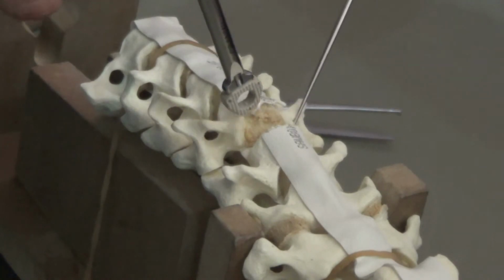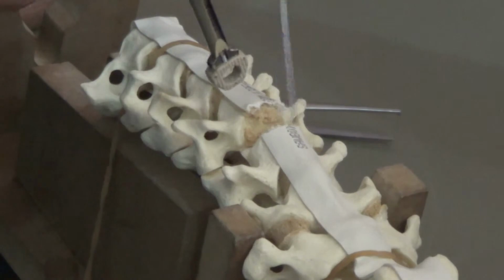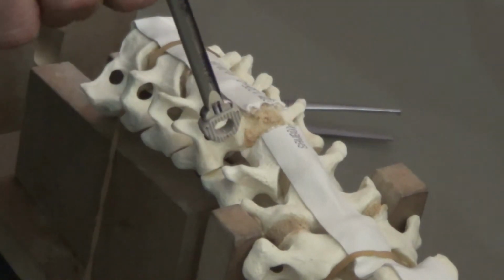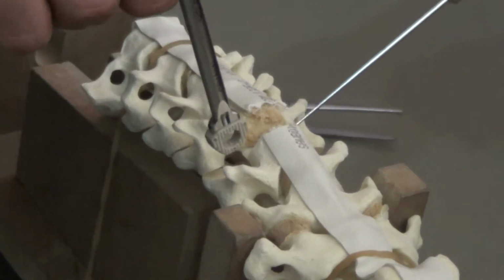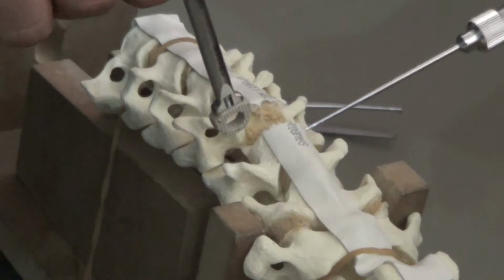Laterally, you will go that path. Sometimes we go up to this uncovertebral elevated part, this upper part and lower part, this sort of joint formation, the uncovertebral joint. As you see, this is posterolateral. This remains in exactly this position.